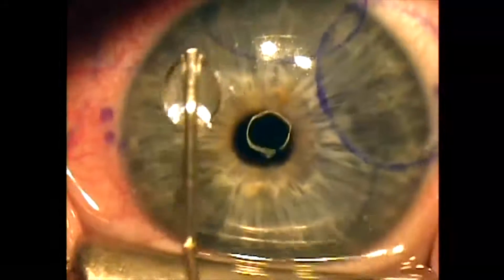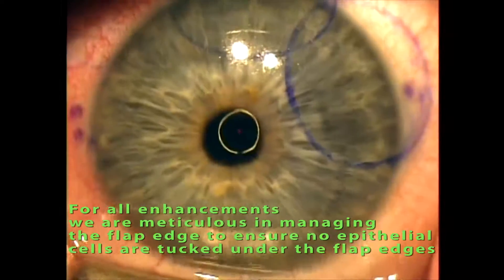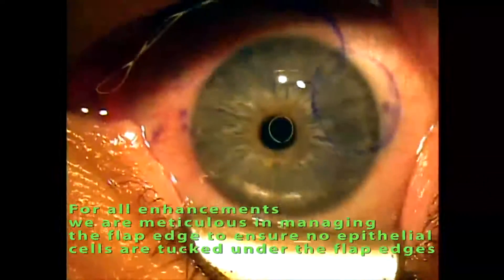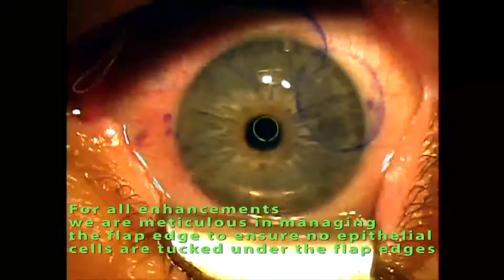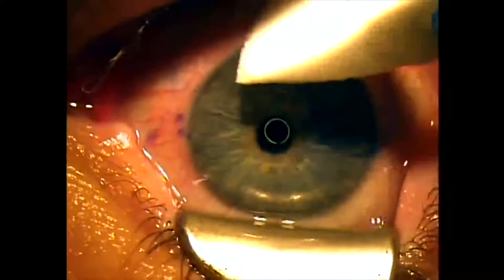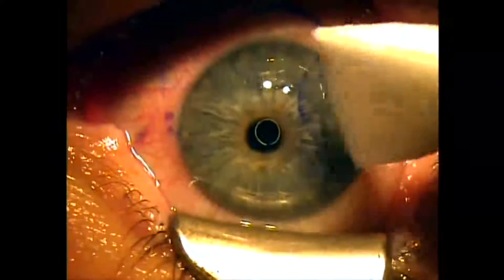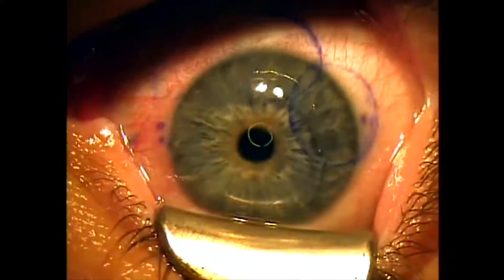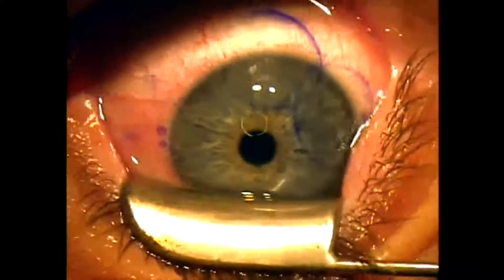These are meniscus-edged flaps because they were made with a microkeratome, so they do have a higher chance of having epithelial cells growing underneath the flap edge. I find that the femtosecond flaps we create using the Intralase laser have a squared edge, and the rate of epithelium growing underneath the flaps on re-lifting Intralase flaps is much lower than the recurrence of epithelial cells on microkeratome flaps such as this one. So I use a micro sponge to make sure my flap is in good position and that there are no tags of epithelial cells underneath the flap. And that completes the LASIK enhancement.